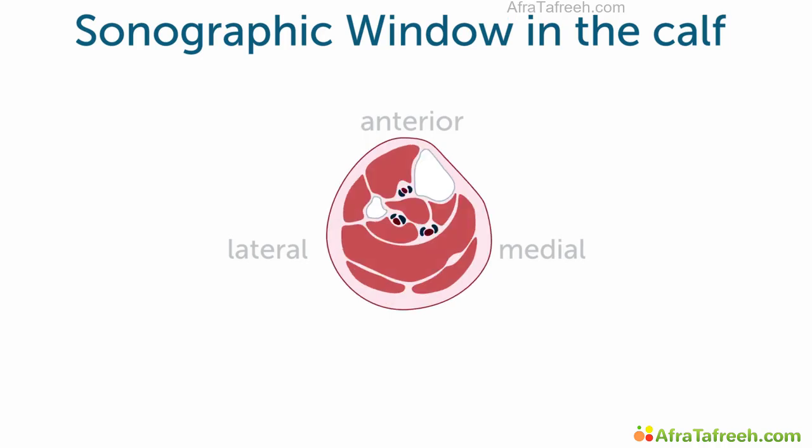And again, in the mid to lower calf, we may change slightly our transducer positions and see the peroneal and posterior tibial veins in one view. And if we're struggling to see those peroneal veins down here, we might come from the posterolateral approach as we could do here.